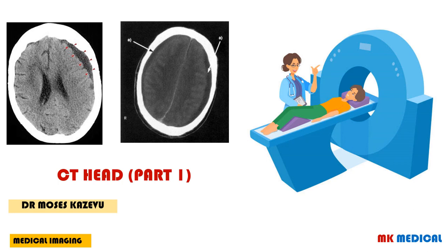Note that this will not be an exhaustive thing, and it's only to help you understand the basics of CT scans, such that in an event that you don't have a radiologist or a radio technician to interpret the CT scan for you, you can still have an idea and still manage your patients accordingly.